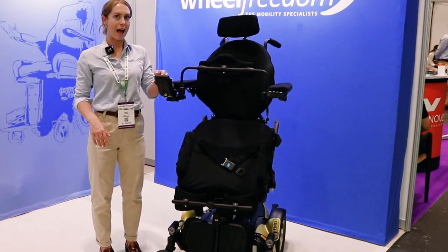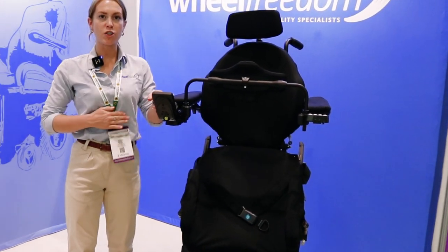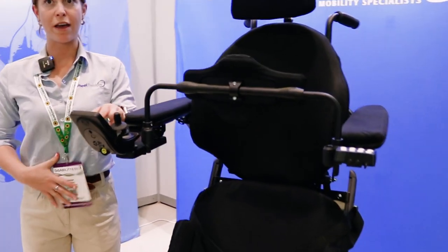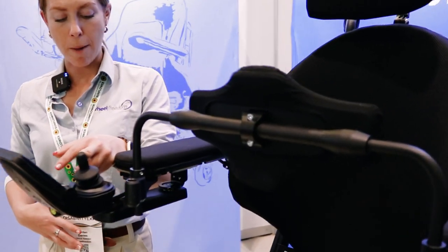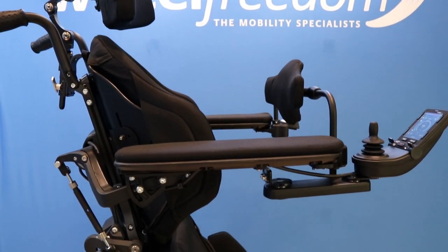Coming up into a full stand, what we've got here in front of us is a chest bar. Quite commonly we'll see people with a loss of trunk control who are using these chairs, so that's just a safety feature here across the front.